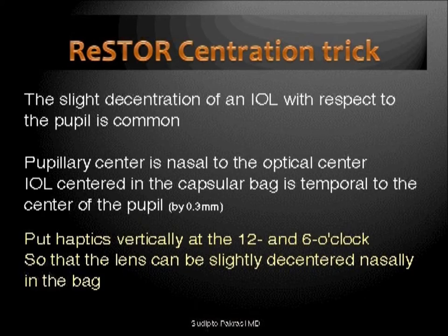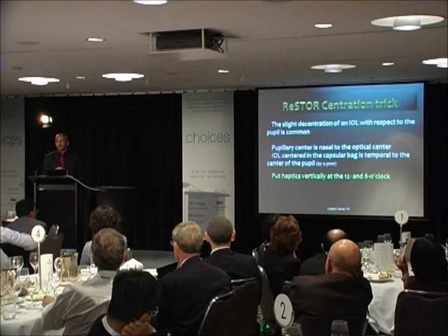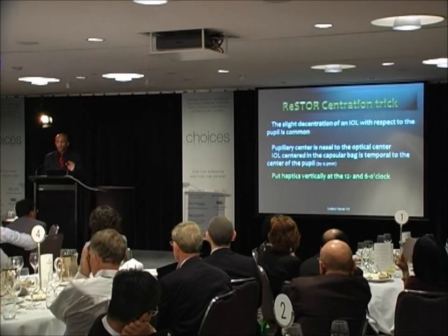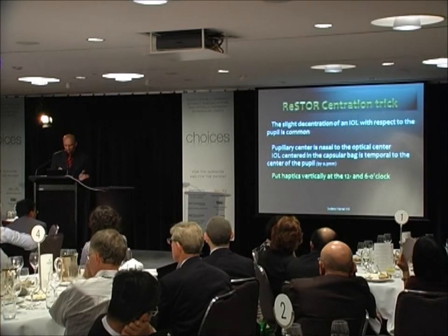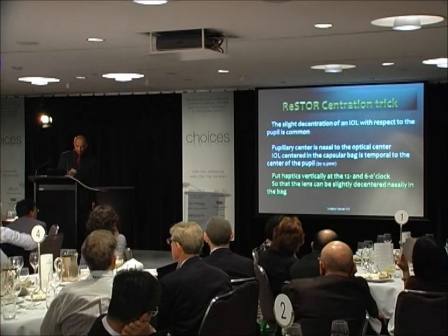So what we do is we place the lens at a 6 to 12 orientation, and after the viscoelastic has been removed from the back, tap it back and move it slightly nasally. So what you're going to get is the lens is going to sit just bang on the center of the pupil. Now this should work in most of the cases. You have to have your pre-op impression noted in the pre-op chart so that you are aware which person to do more, which person not to do. So these are things which are very individualistic; you have to look into them.